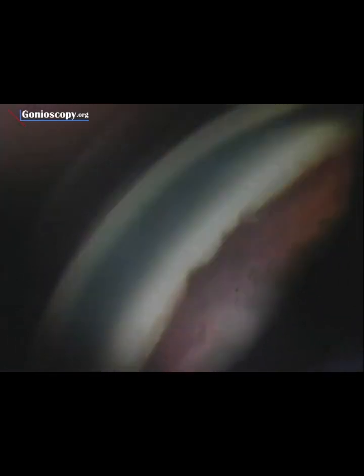We feel that this patient has ocular ischemia beyond his neovascularization from diabetes because he had a painful eye that remained painful even with a pressure of 25 millimeters of mercury. This patient has had multiple surgical procedures for glaucoma. When we look at the inferior angle, we can see these intermittent peripheral anterior synechia. We know that these are synechia because we can see the pigment anterior to the adhesion on the cornea.